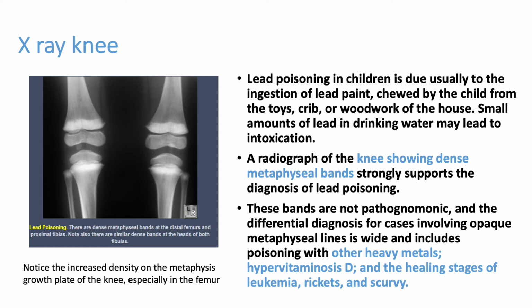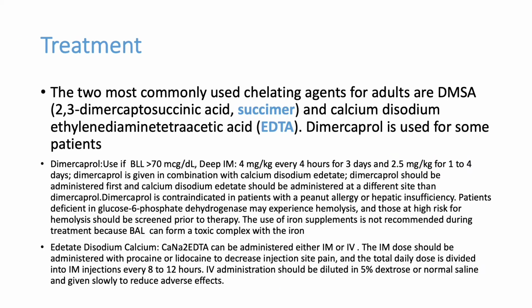So metaphyseal bands are classically seen in lead poisoning, especially in children. These patients may require treatment with succimer or EDTA.